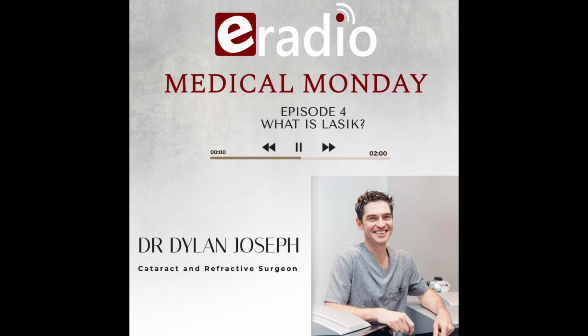People thought that, well, if they've got a scarred cornea, they've had a foreign body, or an injury to the cornea which has changed the shape, or something that has scarred the cornea, even an infection. We can measure the depth of those scars now, and we can use the laser to remove the scar, and sometimes to reshape the cornea to get the optical shape of that cornea better, to try and improve your vision.